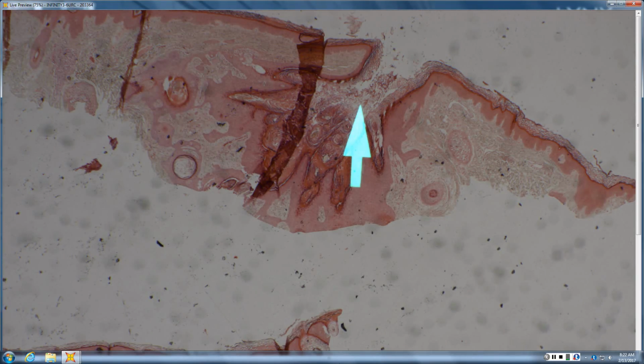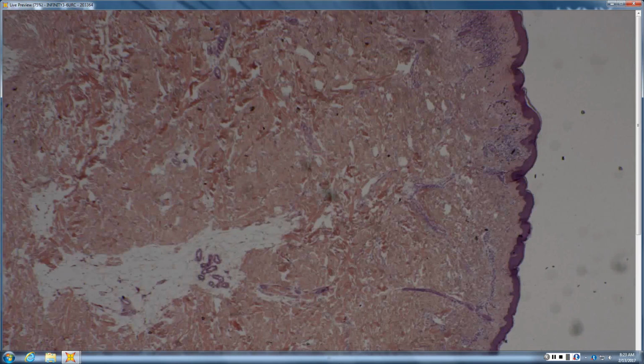widened follicle with some material being extruded out. So a big mama follicle and lots of little follicles emptying into it. Like a trichofolliculoma. Very good. I actually think it's a trichofolliculoma. Yeah, I know. I always get those.